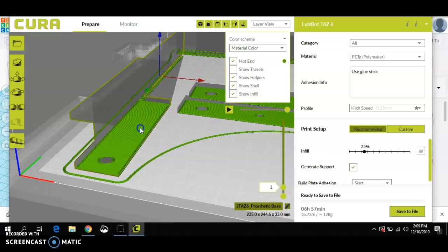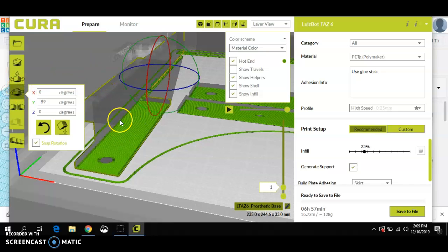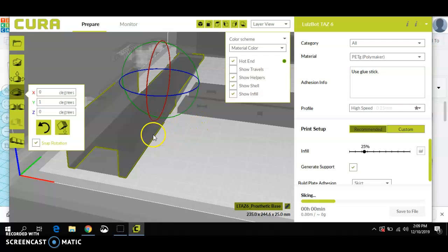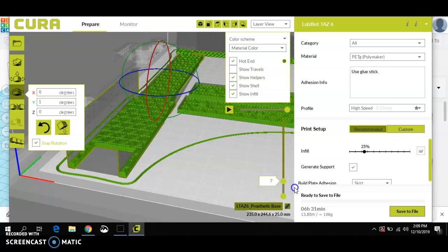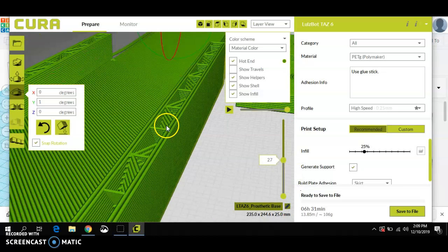Now, I rotated this object mostly just to show that if we can avoid it, we'd rather not print all that infill. It's more material that we just have to break out and throw away. So I'll go back to the way this was originally oriented, and you'll see oriented this way, there's just no need to print infill anywhere. I always like to avoid printing support, rather. I'm using the wrong term. I like to avoid printing support if I don't have to. Infill, I've been using incorrectly.